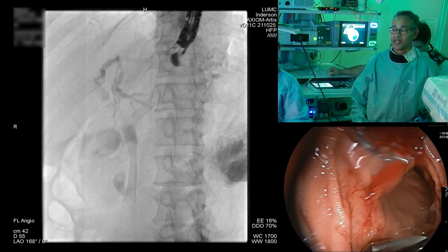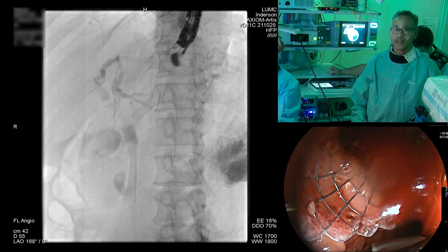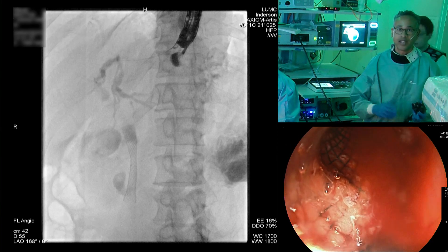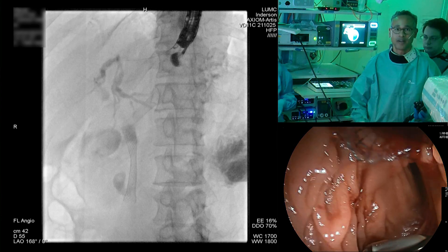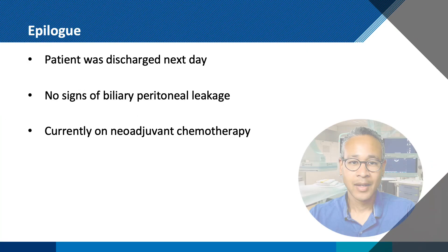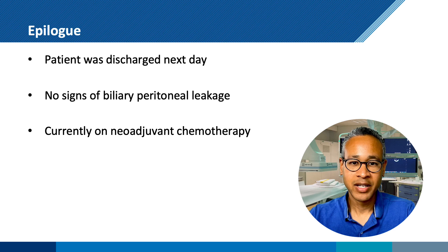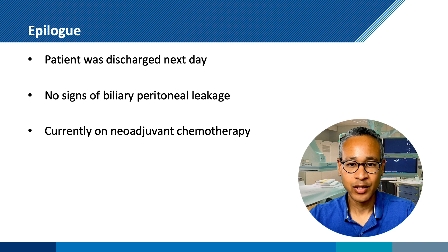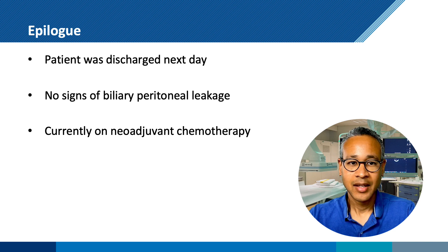This is, I hope, a nice demonstration of EUS anterograde drainage with anterograde placement of a self-expandable metal stent. The patient was discharged the next day without any signs of biliary peritoneal leakage and is currently on neoadjuvant chemotherapy. Keep in mind that if you apply anterograde biliary drainage, you have the option of anterograde stenting as well as EUS hepaticogastrostomy if needed. Thanks for your attention and see you on the next one.